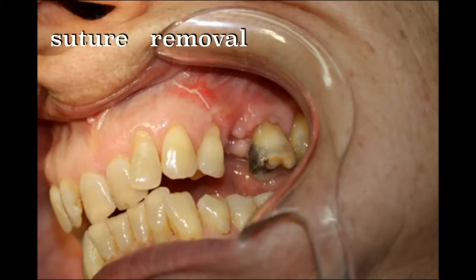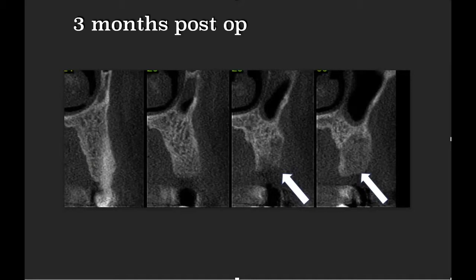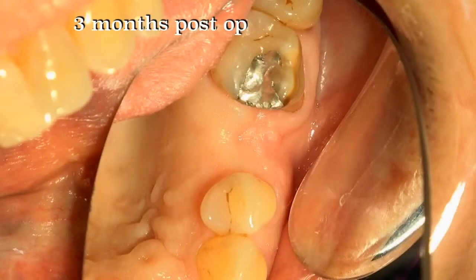That's how it looks after suture removal. That's how it looked in the CBCT. And here you can see the new vital bone that was built in that area, and we have a large amount of vital bone. Three months post-op, soft tissue appearance, occlusal view.